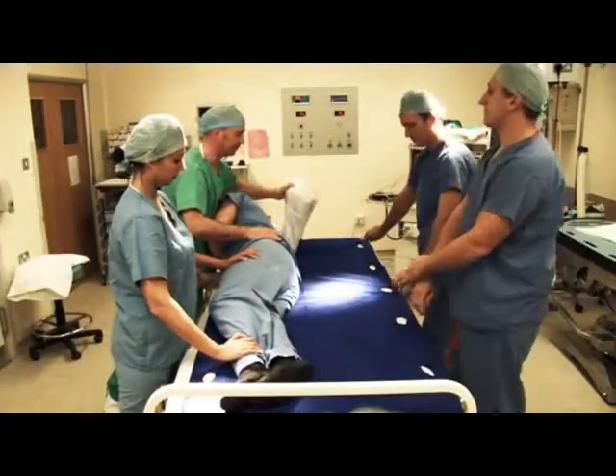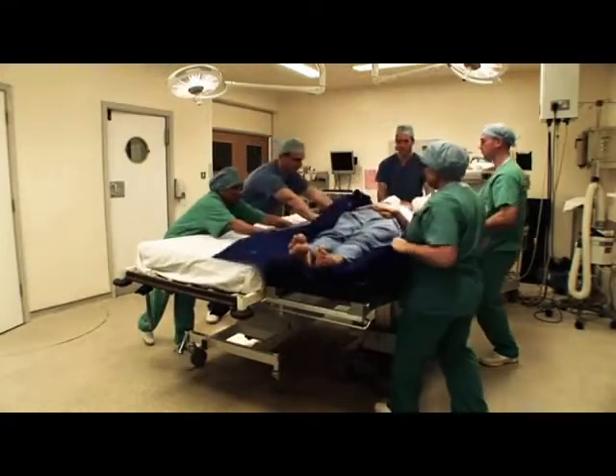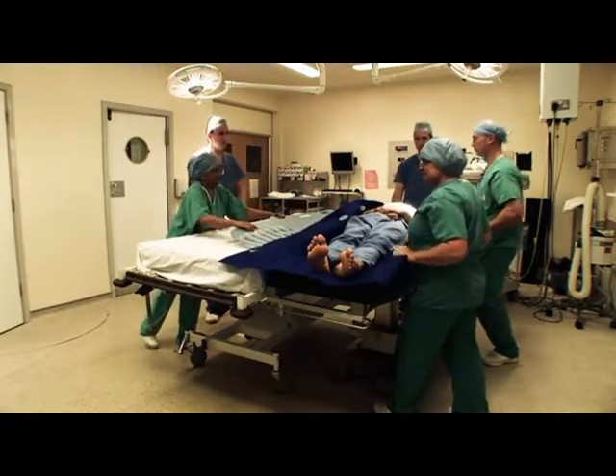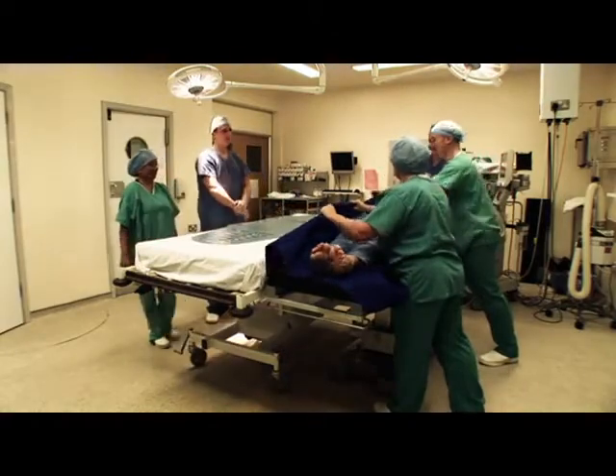Staff are able to perform manual handling safely because the FlexiSlide is wider, allowing easy reach and preventing overreaching. It also has a high safe working load, which means staff have the confidence that FlexiSlide can take the weight of their patients, including bariatric or obese patients. Because the benefits are inclusive, staff are able to concentrate on the technique or the transfer at hand.